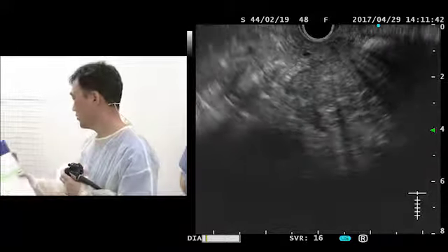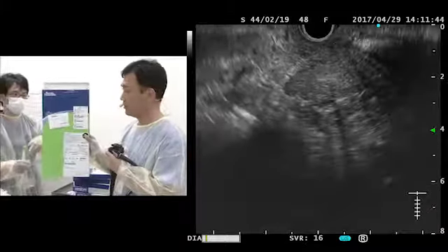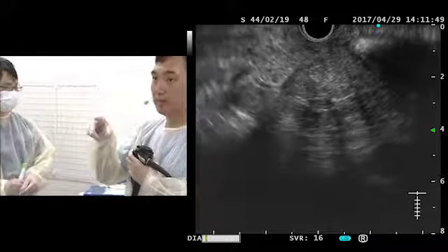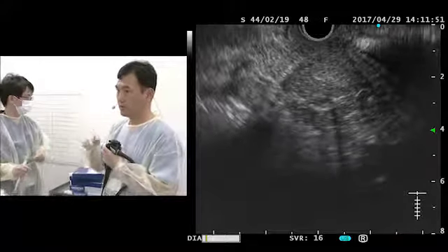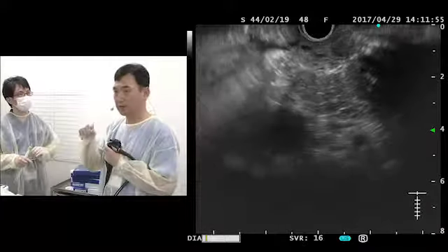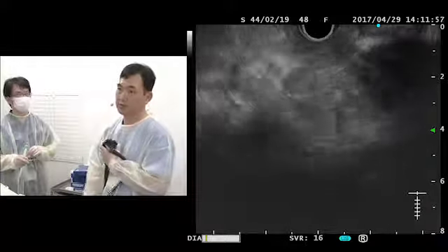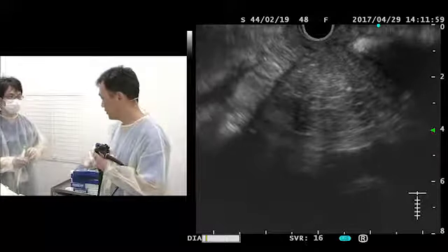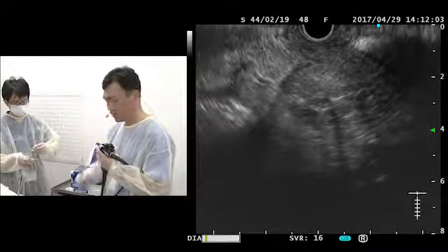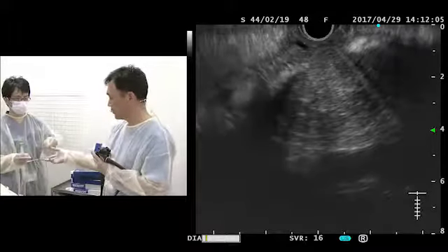Boston came up with the Acquire needle, which has 3 prongs at the tip of the needle. That's supposed to provide you with a little more chunk of tissue than just aspirating cells. Most of the time we do the slow stylet pull method that reduces contamination of blood rather than just aspirating with the syringe.